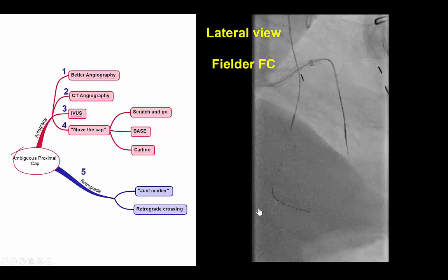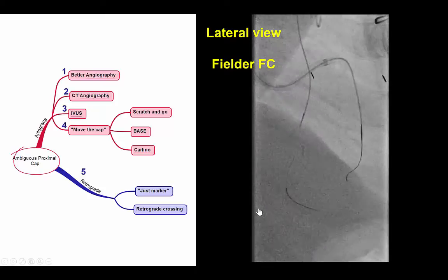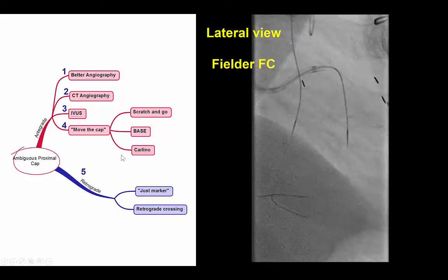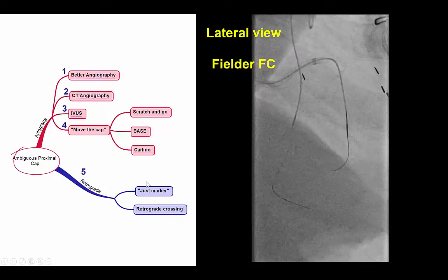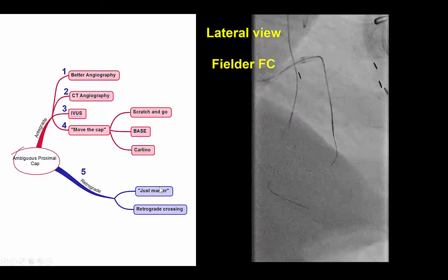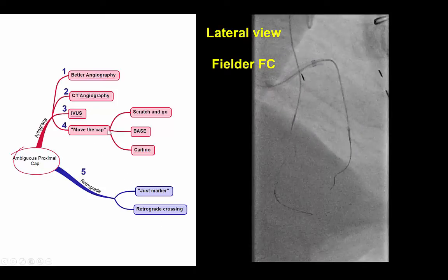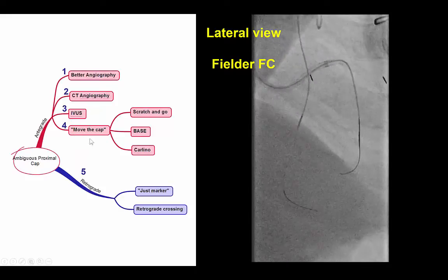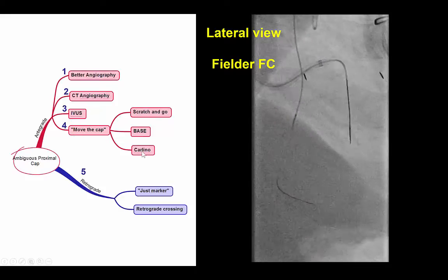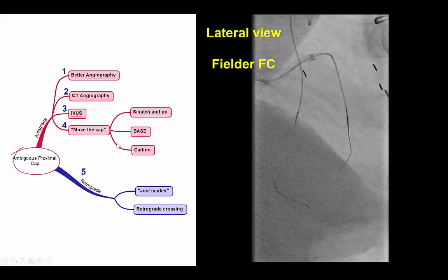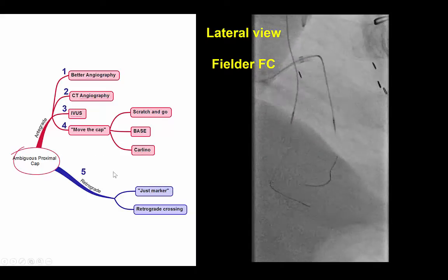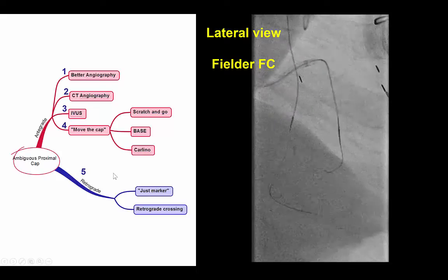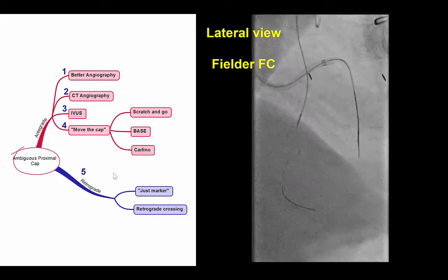In cases like this where we have proximal cap ambiguity, there are many ways to resolve the ambiguity. Some of them involve the retrograde approach, which we tried in this case and was not successful. Others involve intentional creation of dissection — these are the move-the-cap techniques like scratch-and-go and base-and-carlino. However, the problem with those is that re-entry is required, which can be challenging in a very diffusely diseased vessel, as in this case.